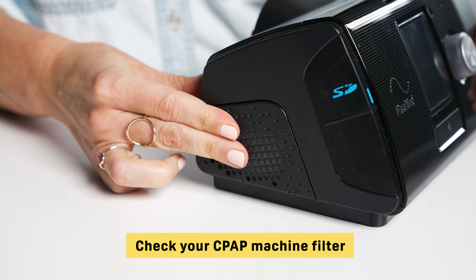Once you have everything fully cleaned, don't forget to check your CPAP machine's filter. These should be replaced every two weeks, but if your machine has a reusable filter, make sure you wash it every two weeks with warm soapy water and fully replace it every three months. Keeping your filter clean is really important for your respiratory health and for maintaining a functional machine. Cleaning your CPAP machine ensures you're breathing the cleanest possible air each night. For more information on how to clean your machine, head over to sleepfoundation.org.